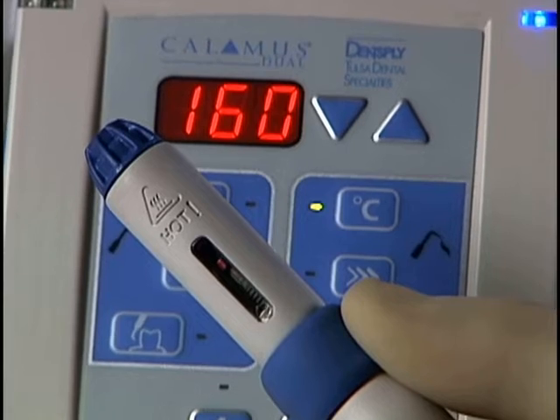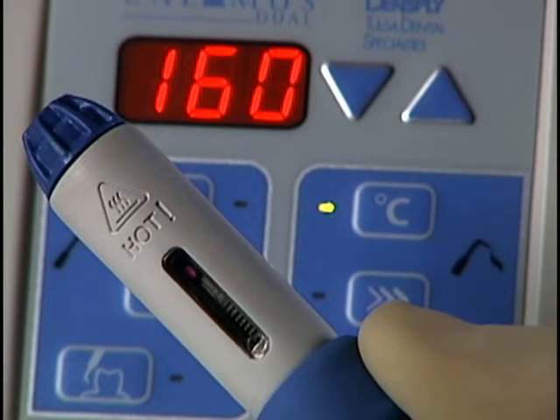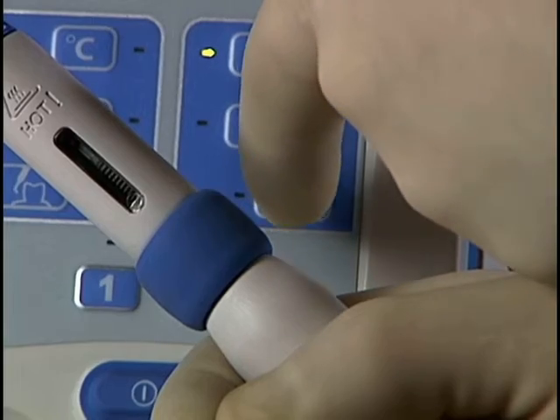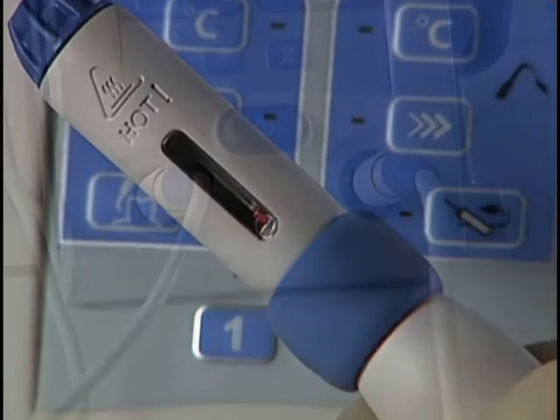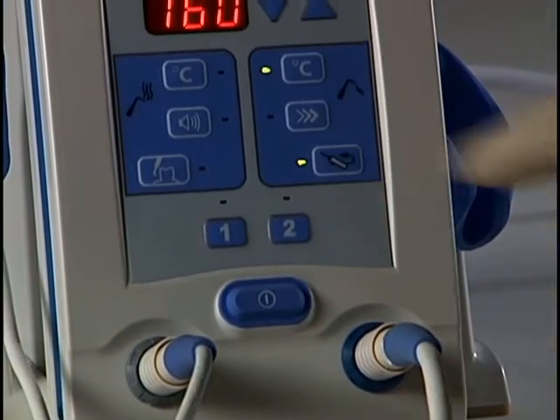Annually, the flow handpiece should be cycled without a cartridge. Press and hold the activation cuff until the indicator moves all the way to the end. Then push the return button and allow the indicator to completely retract. Should the indicator ever not fully retract, push the return button a second time.